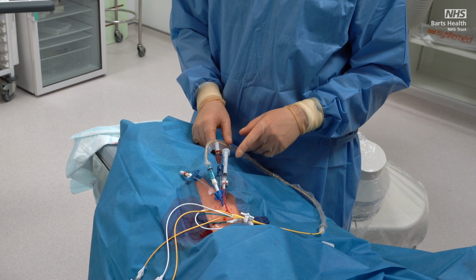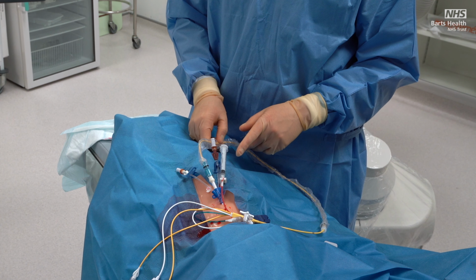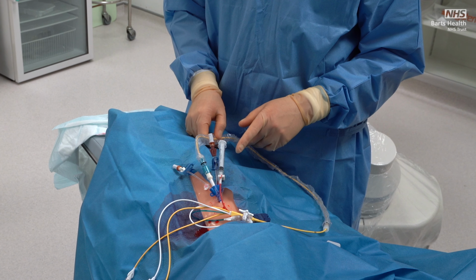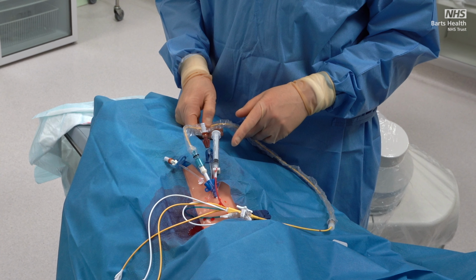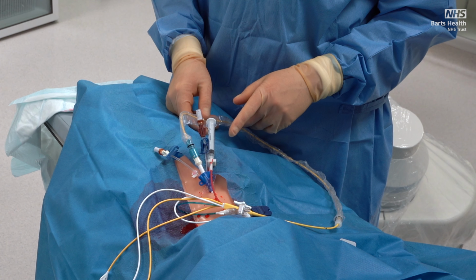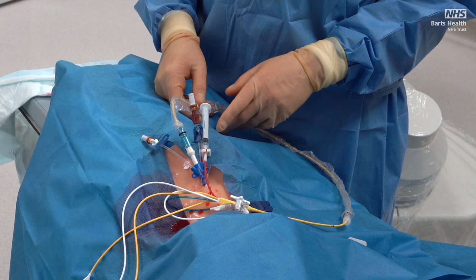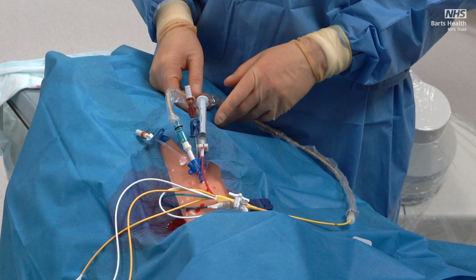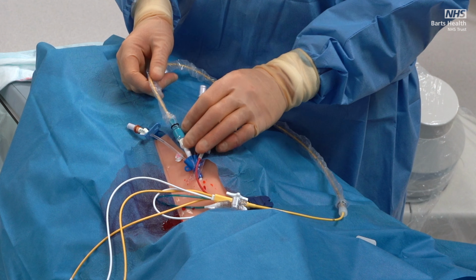Confirm a zero trace of the PA catheter monitor, and then that the scale is appropriately set for the size of the expected waveform. Typically this will be 0 to 60 millimeters of mercury. Firstly, check that you have a right atrial or central venous pressure trace. This confirms that you are in the SVC.